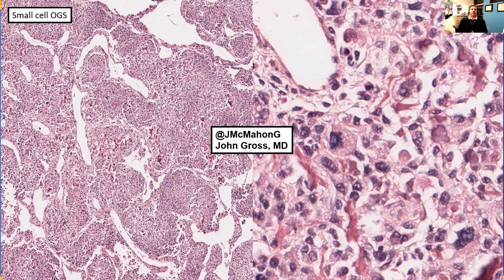Osteosarcoma is also seen here on the left with a filigree pattern of osteoid with primitive cells seen at low to intermediate power. On the right, you can see that these primitive cells are directly producing this mineralized matrix. While the cells are quite small, there is a little bit of cytologic atypia, although that's sometimes subjective. The key point is that these primitive cells are directly producing the mineralized matrix, which has a very wispy and lace-like calcification pattern.